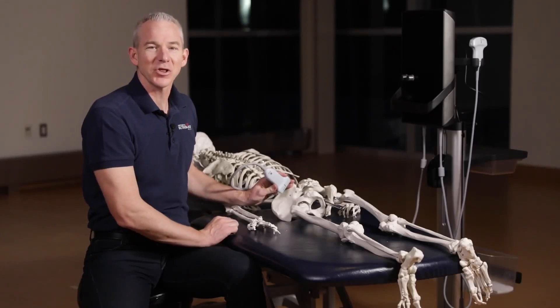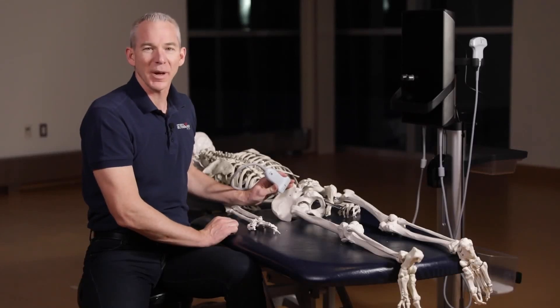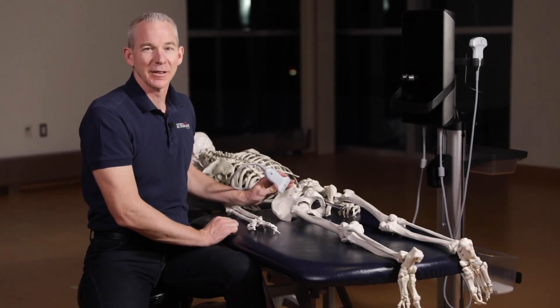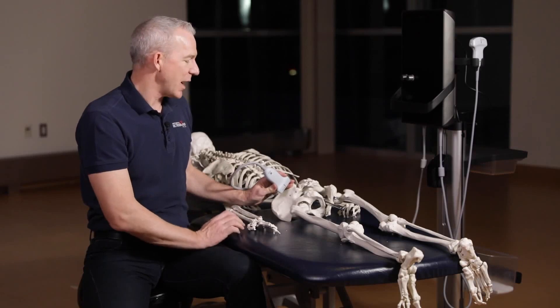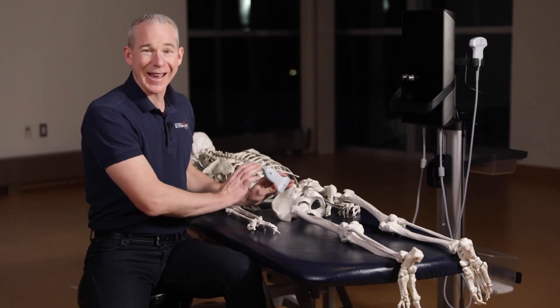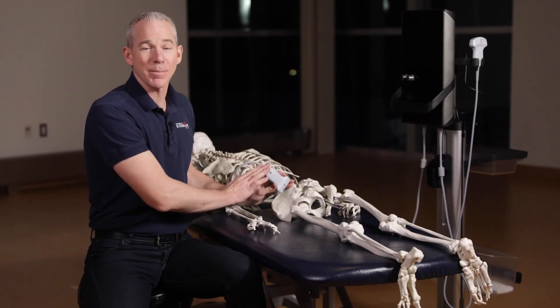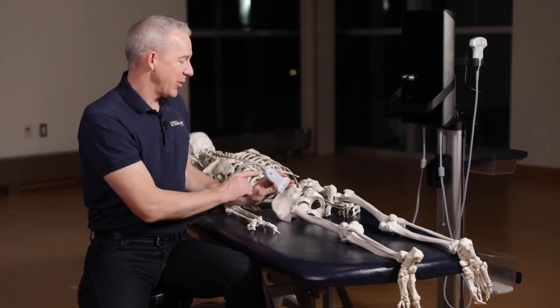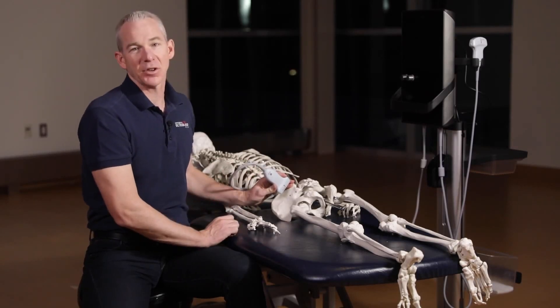Hi, Dr. Frank Johnson from Sport Medicine Ultrasound Canada. I'm going to show you how to find the sciatic nerve as it emerges from the pelvis at the greater sciatic notch.